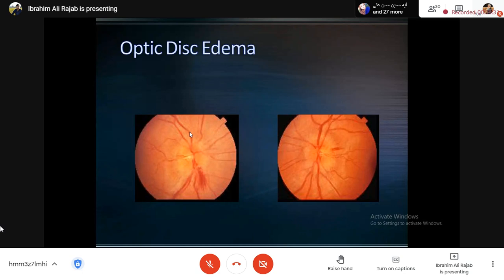شكرا أيان. يلا آية حسين. آية حسين. نعم دكتور. نعم دكتور. يلا آية. فهي قالت أيان إنه the disc is not well demarcated or has a hazy margin, and this is the first sign of optic disc edema. And you should notice another sign, which is clear in the image. Optic disc swelling. Yes. نعم.